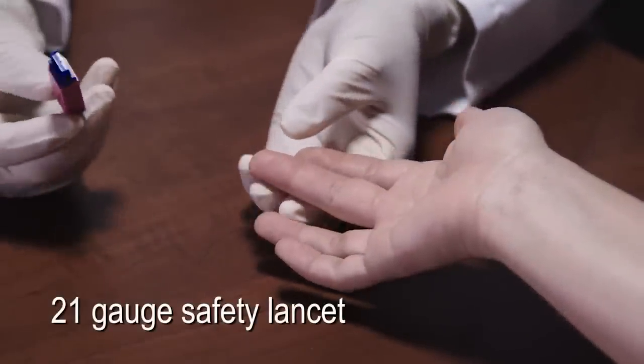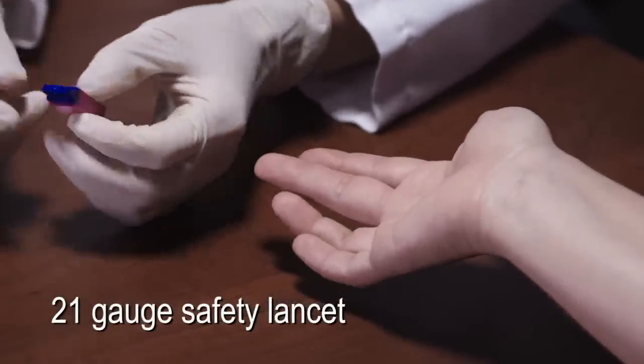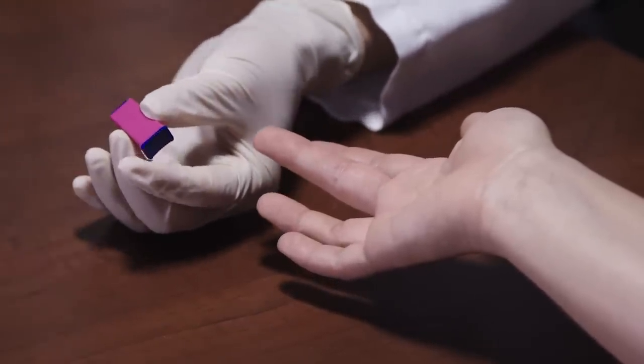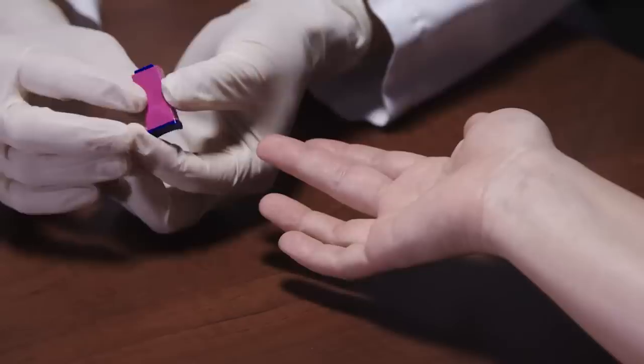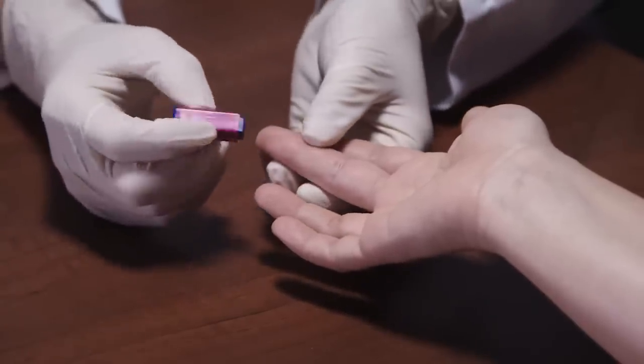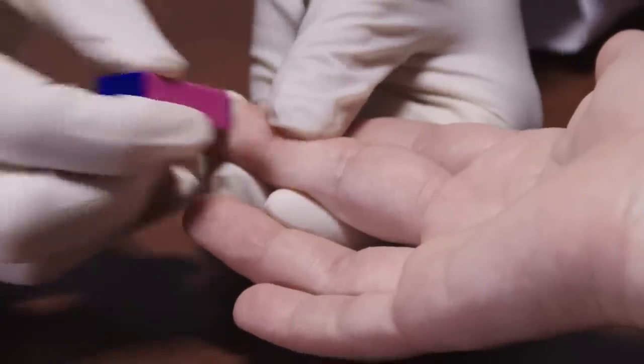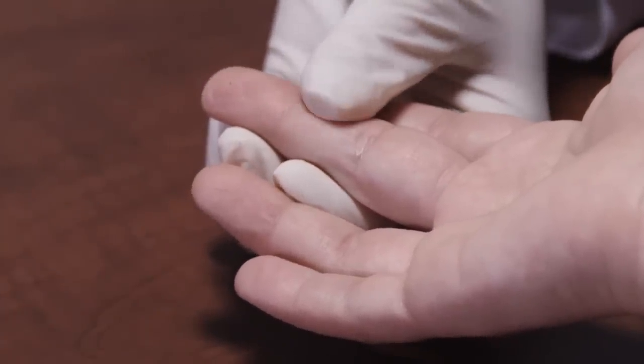We recommend a 21 gauge single-use safety lancet. Hold the safety lancet and carefully rotate and pull off the protective cap. Press the lancet against the puncture site tightly to lance the skin. Discard the lancet in an appropriate sharps container.